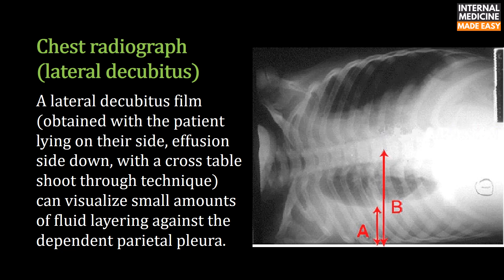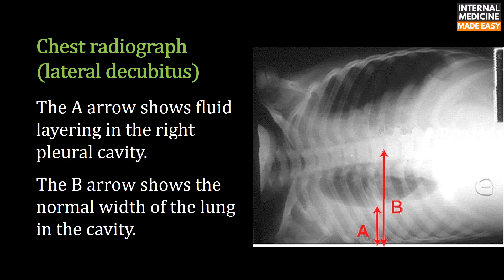Lateral decubitus: A lateral decubitus film is obtained with the patient lying on their side, effusion side down, with a cross-table shoot-through technique. This can visualize small amounts of fluid layering against the dependent parietal pleura. In the right-sided image, the A arrow shows fluid layering in the right pleural cavity, and the B arrow shows the normal width of the lung in the cavity.